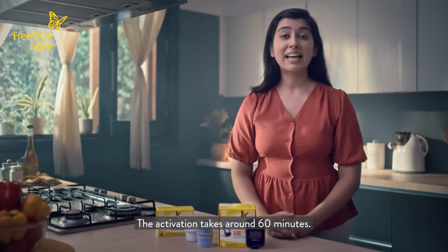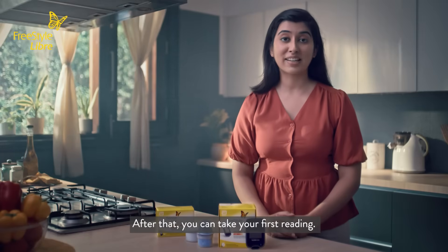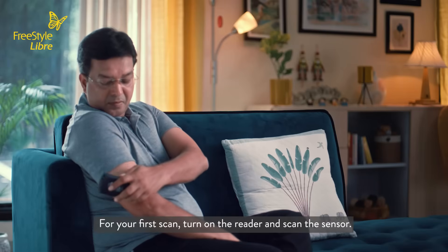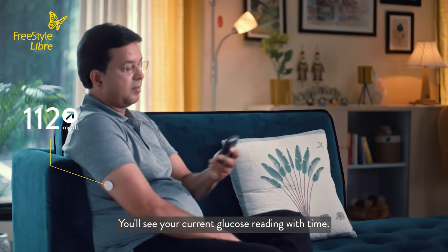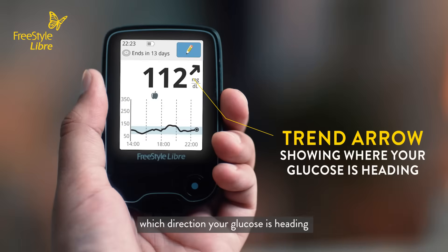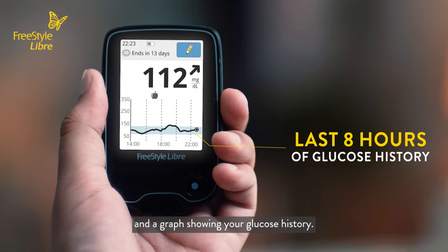The activation takes around 60 minutes. After that, you can take your first reading. For your first scan, turn on the reader and scan the sensor. You'll see your current glucose reading with time, a trend arrow showing which direction your glucose is heading, and a graph showing your glucose history.